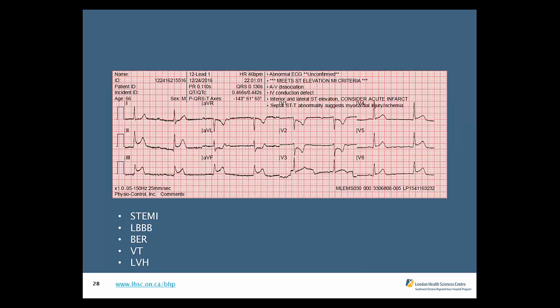And again, as I've alluded to before, not everyone reads the textbook, and you look at these ST elevation segments, and unfortunately they don't have that concave down type of appearance, and they actually almost look like a concave up type of appearance. So again, just one piece of the puzzle, just because it's that way does not mean it's STEMI. It's looking at all these pieces of the puzzle and putting them together. So in this case, I agree this is inferolateral STEMI going on with appropriate reciprocal changes, potentially some ischemic changes in V2, V3, reciprocal changes versus is this potentially extension to the right side versus a posterior MI as well.